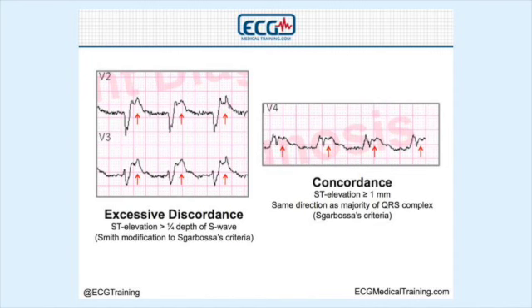We're talking about concordance. Concordance is the most significant thing that you're going to see. And again, that's just the QRS is up, they have elevation. Yeah, if you can bring up a picture... I don't have a picture, but we'll put one on the screen. Let me see if I can Google this really. It should be further down on that page, isn't it? No. Nope.